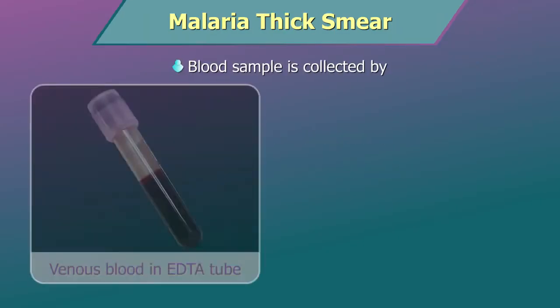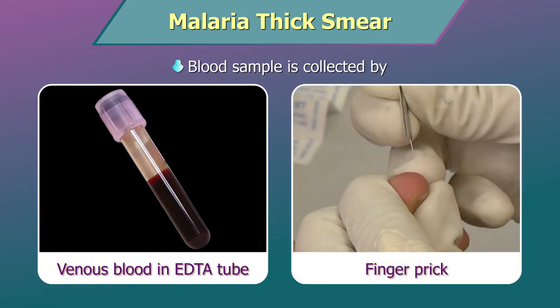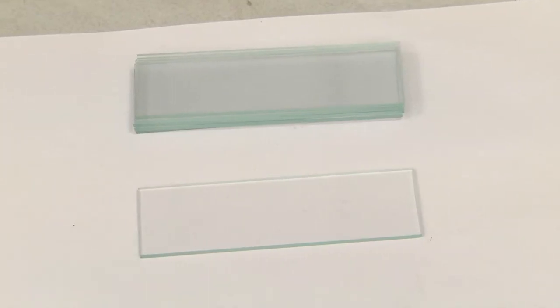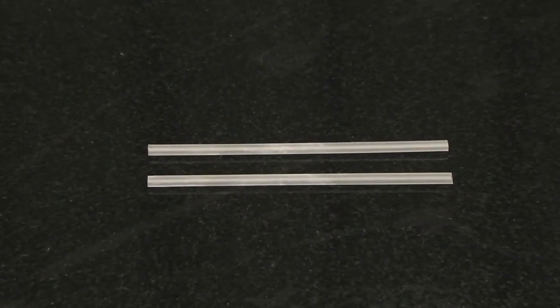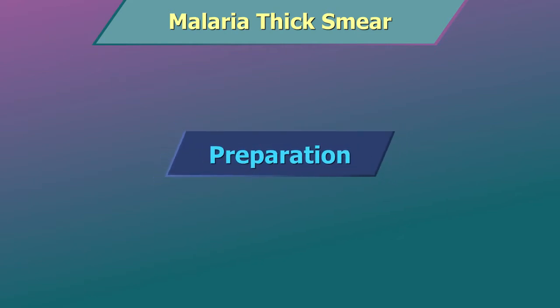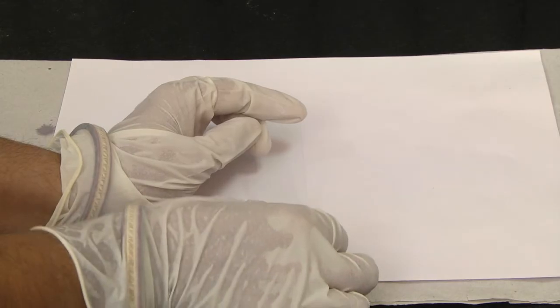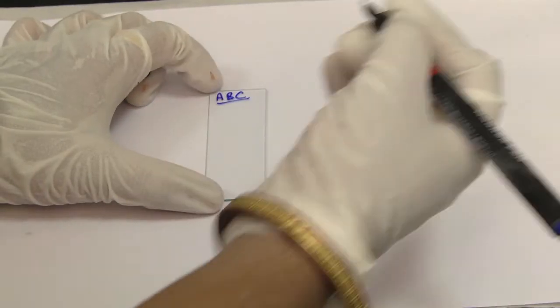Sample: EDTA whole blood venous sample or capillary sample. Equipment: clean, grease-free glass slides and applicator sticks. Preparation of malaria thick smear: use universal precautions while preparing the smears for malarial parasites. Label a glass slide with sample identification number.